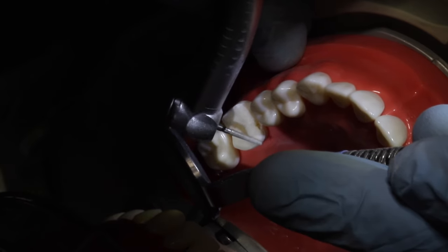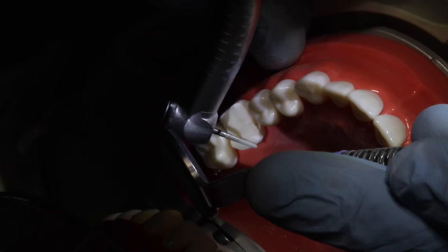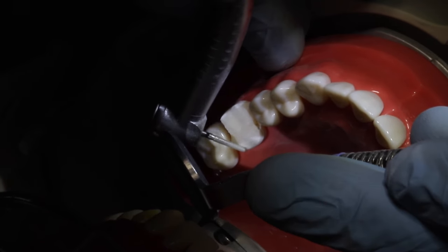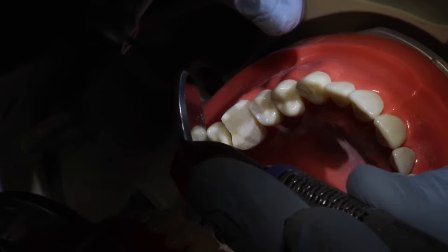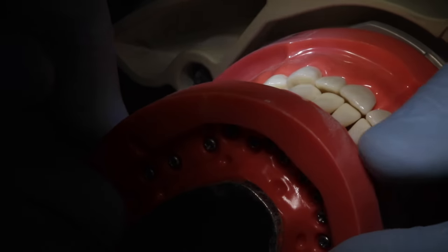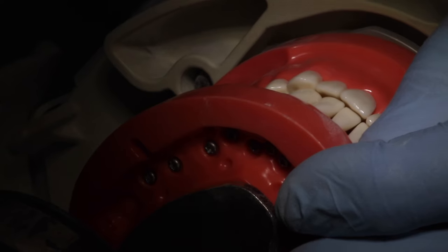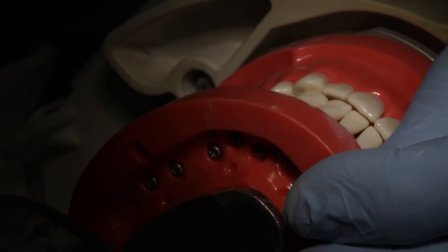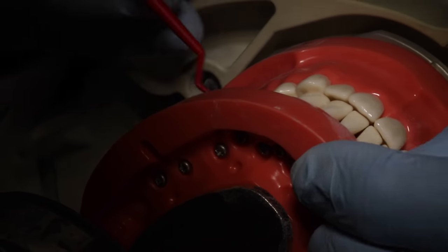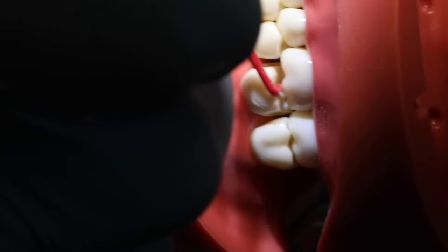Done with this, these cusp tips should line up right underneath, or right opposing, right above the fossa in the opposing arch, and vice versa. So I think we're about there. Let's double check with closing. We'll get out a device to do a little measuring, and the one we're going to use is this red 1.5 millimeter measuring instrument, and we're a little tight.